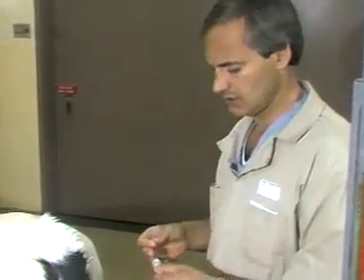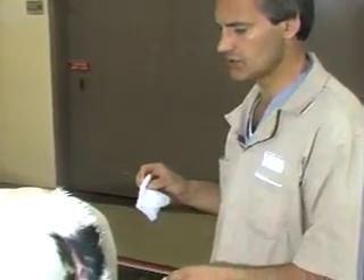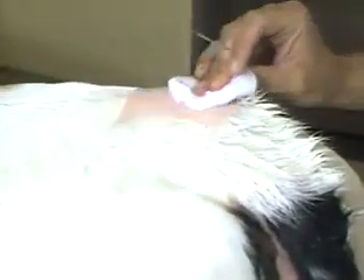Now I'm going to demonstrate epidural anesthesia. This is a very commonly used technique in cattle practice and has many, many uses that I won't go into here. The first and most important aspect is to be sure that the site for epidural injection is thoroughly cleaned.